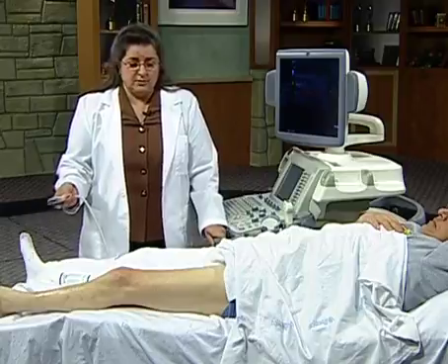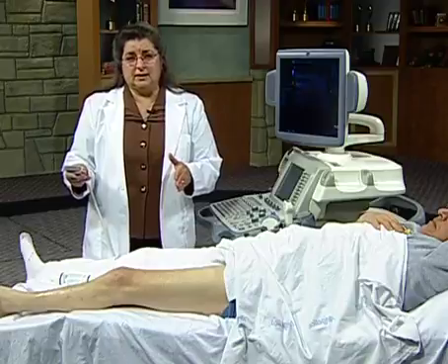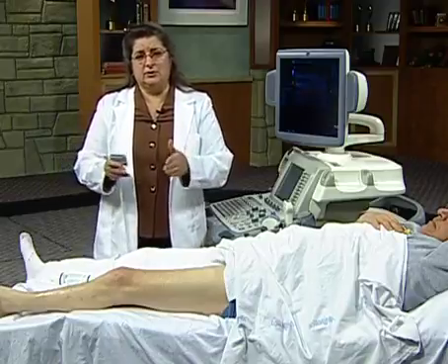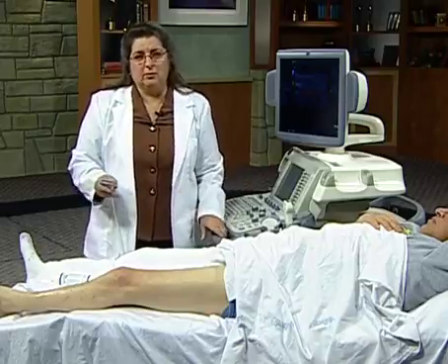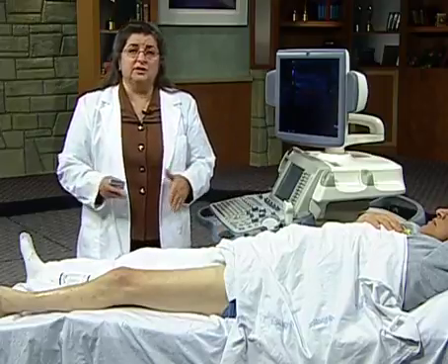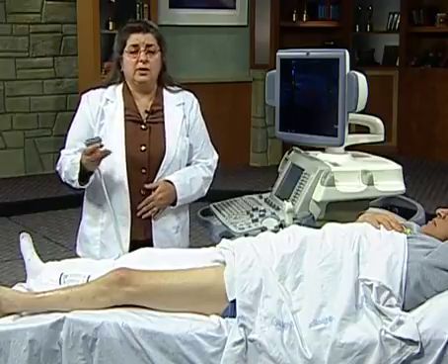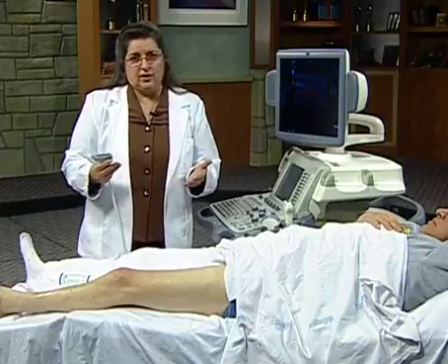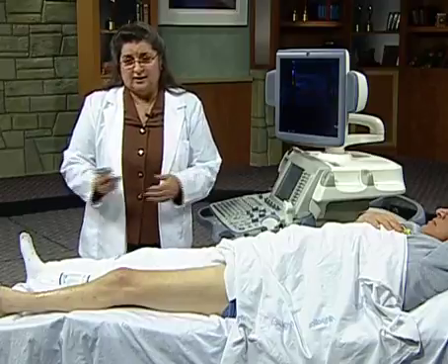We're going to take our velocity measurements, probably no fewer than 5 or 6 measurements at least. Inflow, outflow, anastomosis, and mid-graft, but some folks would like inflow, outflow, proximal, mid, distal. That's probably more appropriate, so that would be 7 measurements of peak systolic velocity. Color images, grayscale images, spectral Doppler, all three things need to be documented so we can make sure that there's no particular variation or artifact that we're misidentifying when we do this exam. And that is how you complete an arterial ultrasound of a lower extremity arterial bypass. Thank you very much.